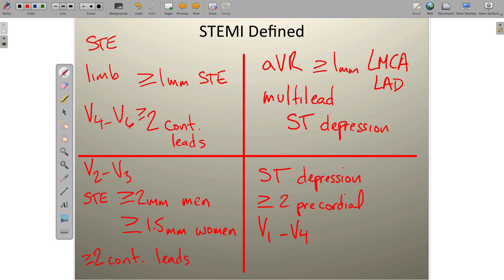To summarize the four rules: we're looking for greater than or equal to 1 millimeter of ST-segment elevation in two or more contiguous leads not involving V2 and V3 — that applies to leads 1, 2, 3, AVR, AVL, AVF, V1, and V4 through V6. For leads V2 and V3 specifically, we need greater than or equal to 2 millimeters in male patients or 1.5 millimeters in female patients.